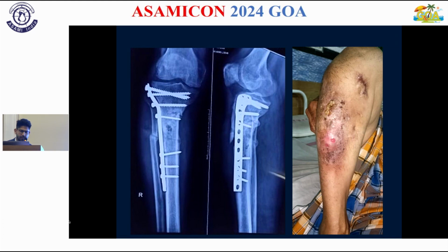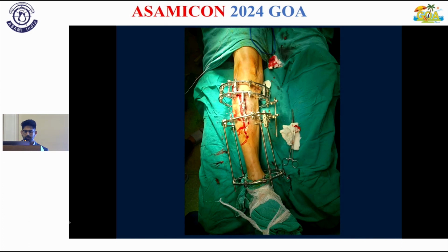Now this patient had a deformity in the proximal part, an infected non-union with implant in situ and a bad skin condition. The hinges and the apparatus will take the shape of the deformity. The proximal unit is applied in reference to the knee, the distal block in reference to the ankle, and the hinges and the motor unit take the shape of the deformity.